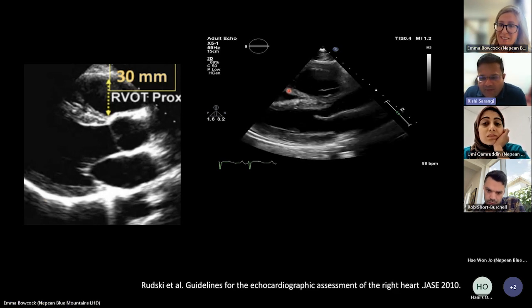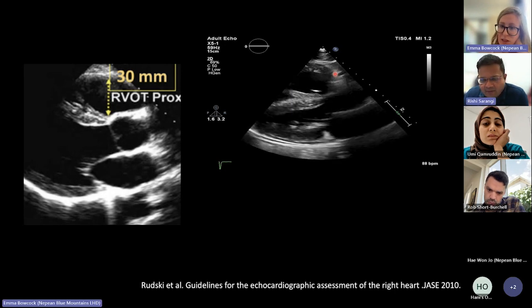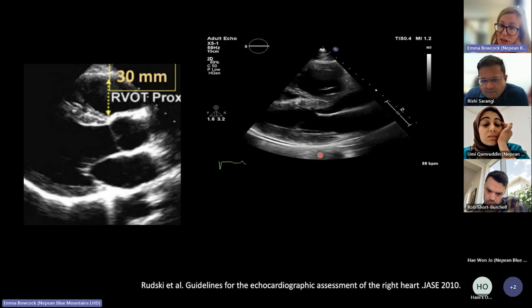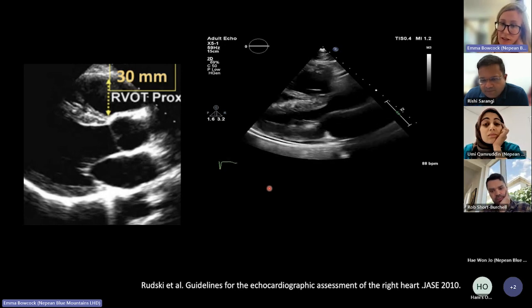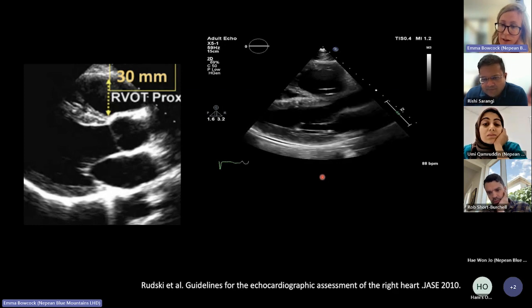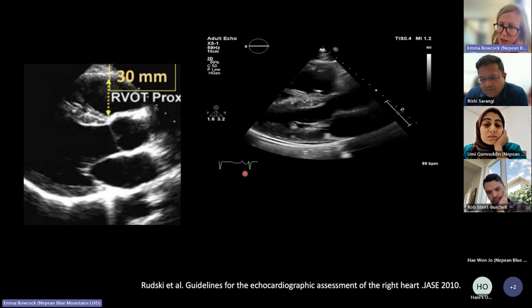Oh, the moderator band, you mean? Yeah, the moderator band. It's beefy, quite thickened. And there's also a small pericardial effusion, which you can find in severe pulmonary hypertension. It's actually a poor prognostic marker. Even just from this one view, and you get so much information from the parasternal long axis, you're already thinking, I think this patient has signs of pulmonary hypertension, of chronic cor pulmonale. Of course, you're going to need to confirm all of this in other views.